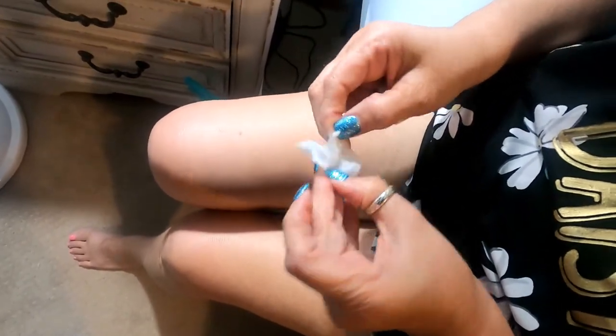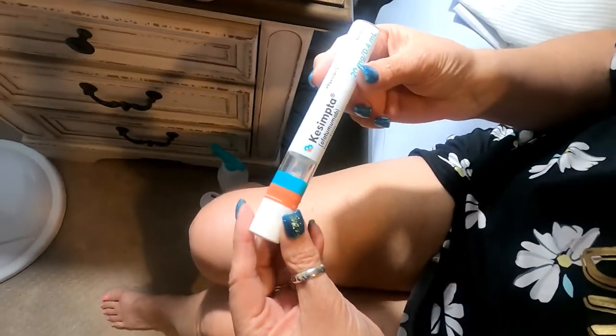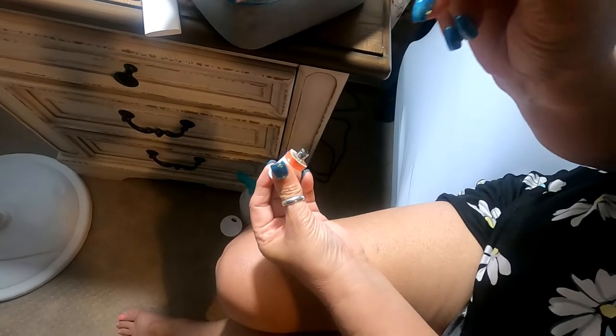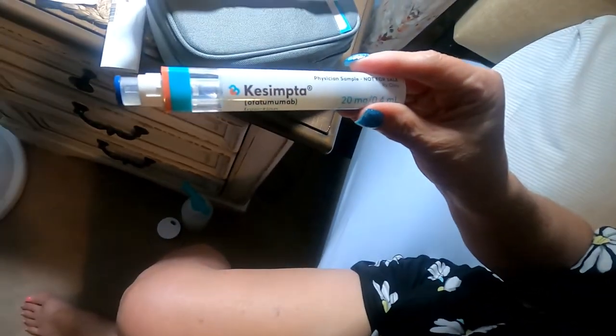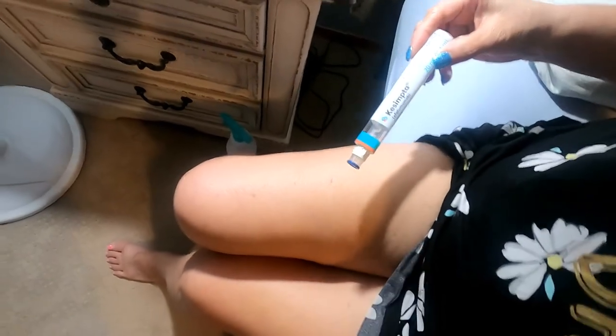I'm going to do my right leg — last time I did the other side so I'm going to alternate. Let me get some better lighting here. You can also do this in your stomach but I prefer the leg area. Just wipe the area well. I'm a little nervous, but you twist off the cap and once you open this you have to use it within five minutes, so just keep that in mind.